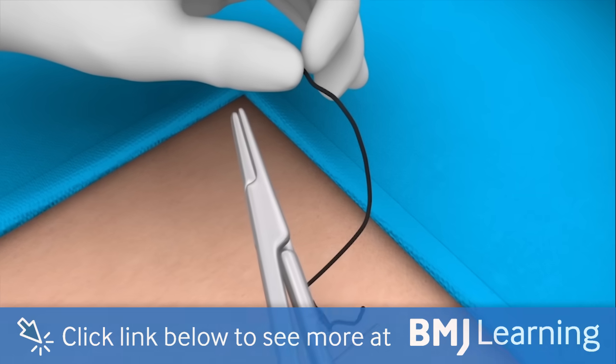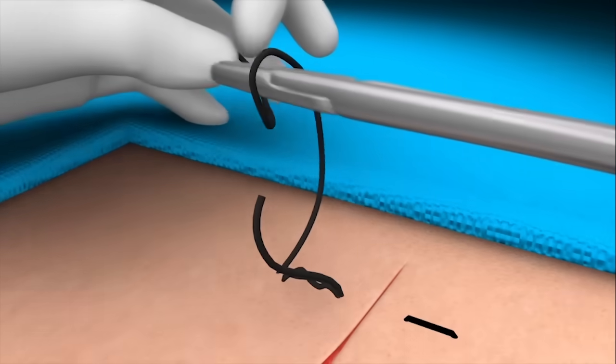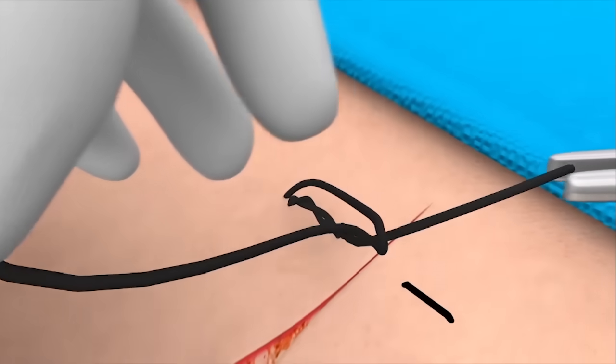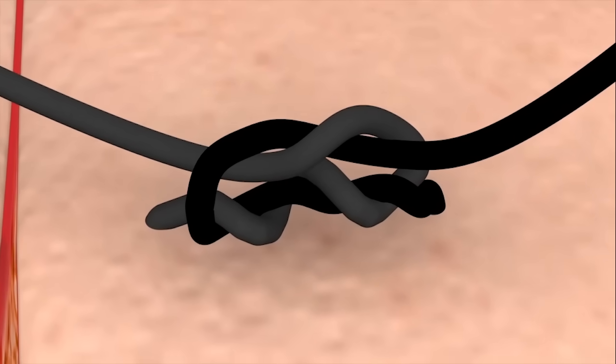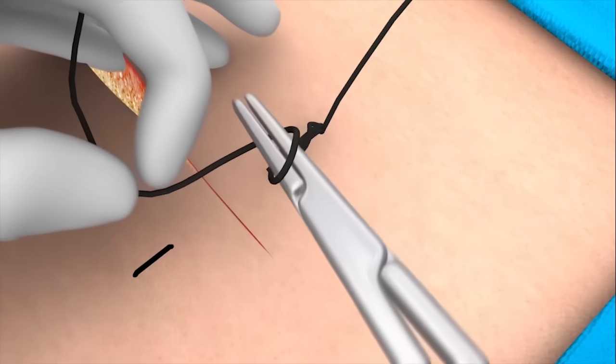This is then followed by a single backwards throw around the needle holder and again the end of the suture is pulled through the loop as it slips off the needle holder. Add a single forward throw in the same way to complete the squared knot.